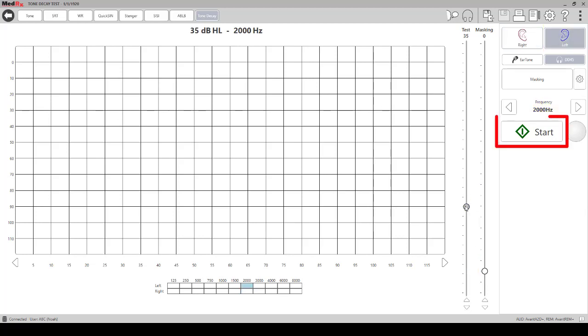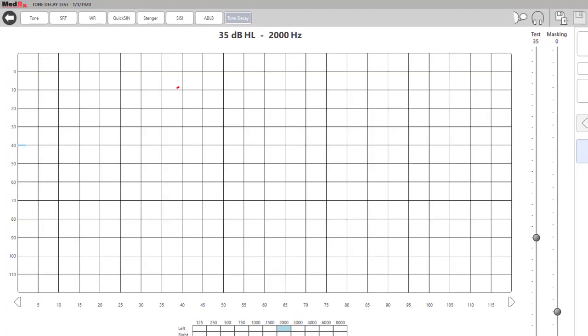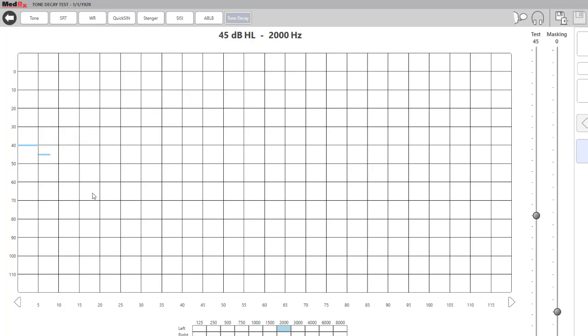To begin, you want to press start, and you can see on the graph that the blue line is moving, and that is when a tone is being presented. If a patient hits the button and they respond that they're hearing it, the line will turn orange.